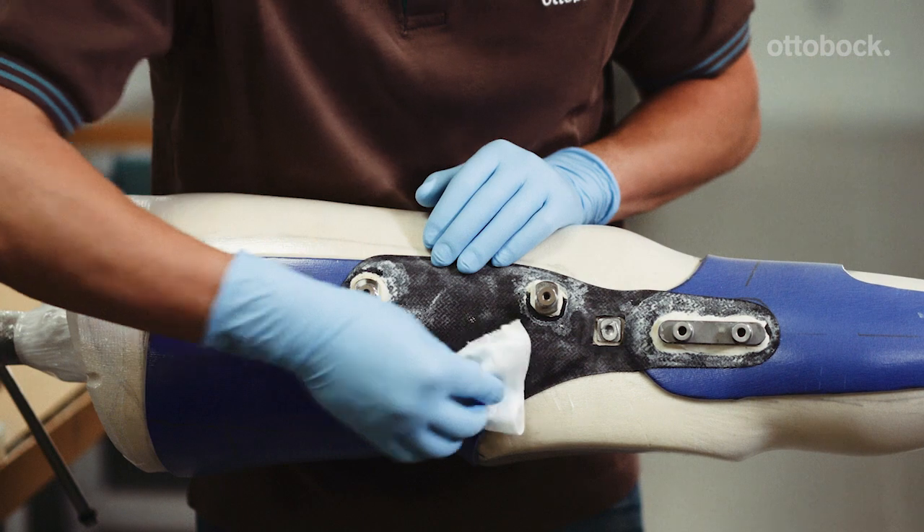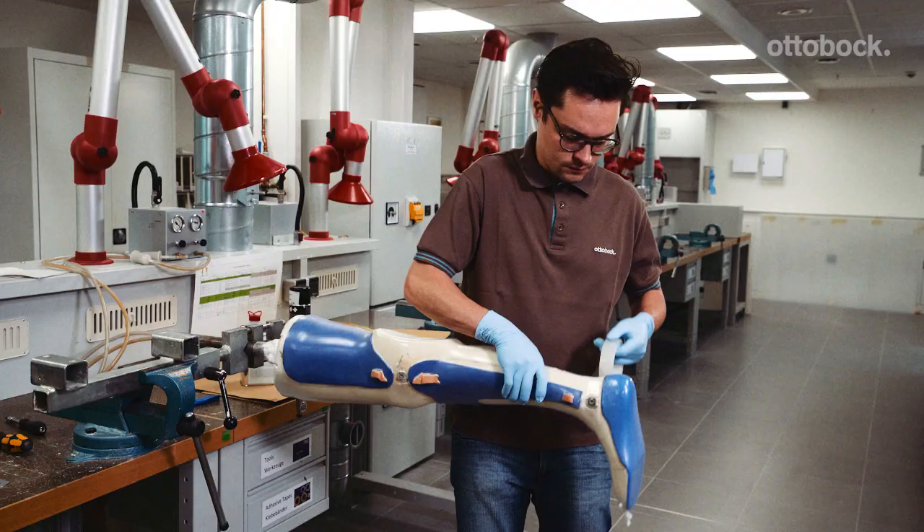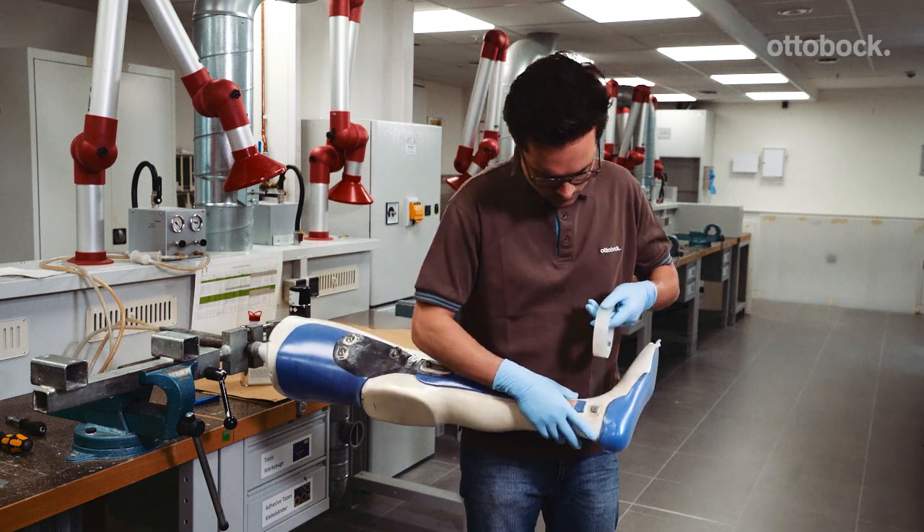Clean the inner shell with isopropyl alcohol and stick a strip of adhesive tape in a circle over the joint alignment adapters on the knee and ankle.